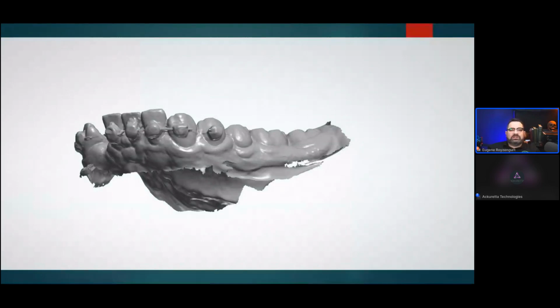I don't do enough printing to where I'm worried about it because I'm a smaller lab. It's just me and my wife here. But if you do a lot of printing, you might want to look into alcohol recycling. What I do is, when the first vat gets kind of dirty, I'll put the clean alcohol from the second into the first dirty one. This way, I just switch vats every time and refill the clean one from that point. Okay.